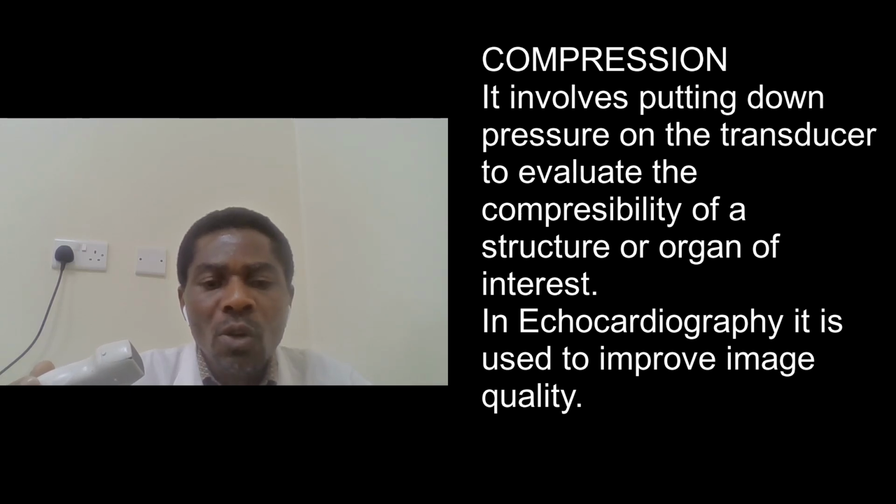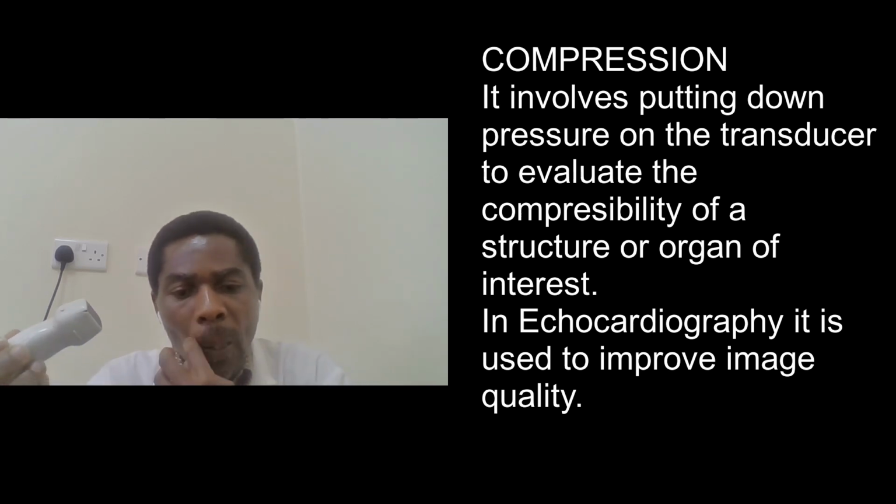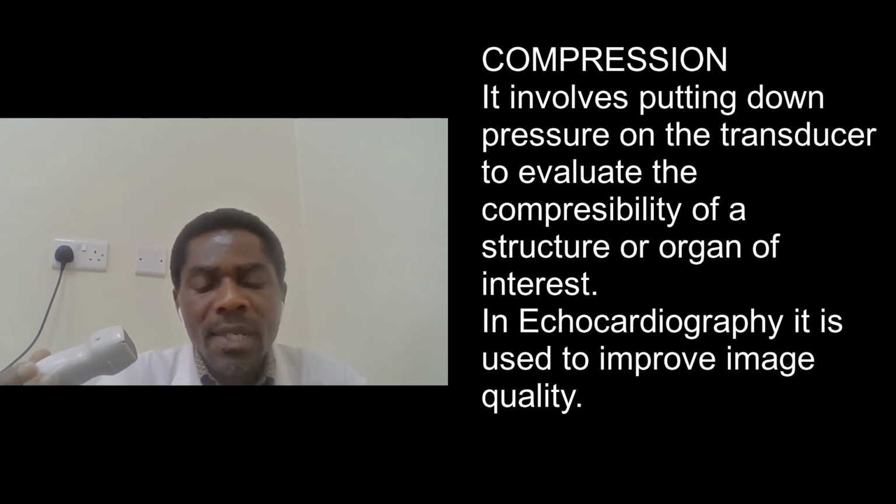Compression can also be used to evaluate appendicitis. So appendicitis is non-compressible. When the appendix is inflamed, it becomes non-compressible.